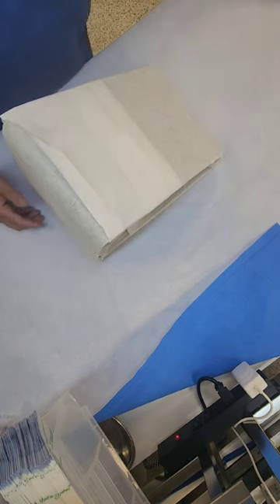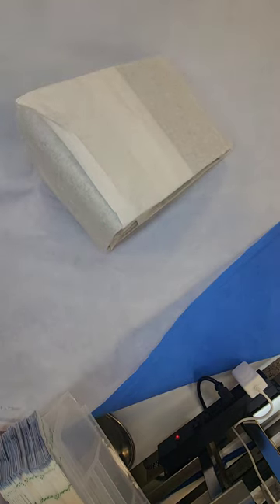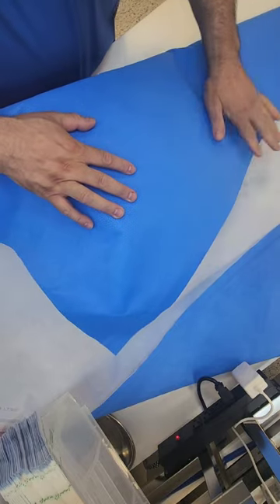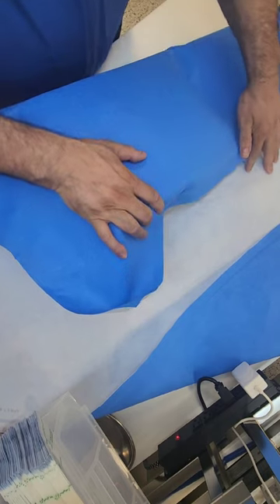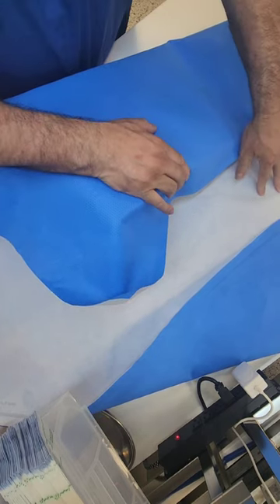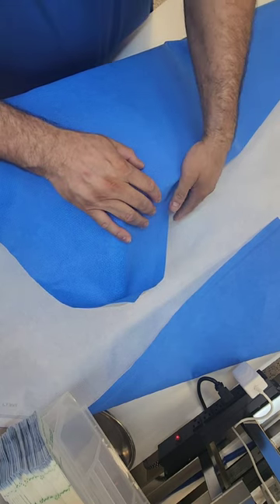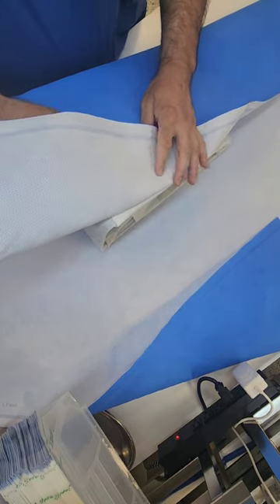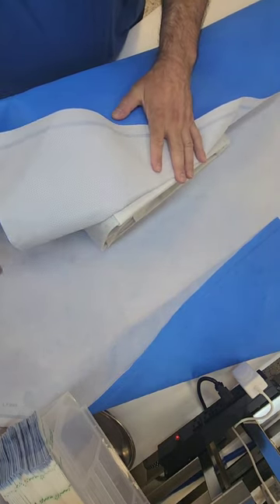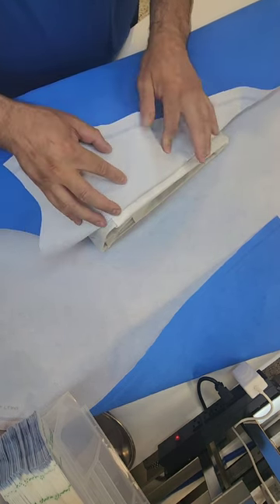Unfortunately, this triangle I have is a larger or medium triangle, and I do not have the correct size wrap for it. This is a 45 by 45. I wish I had a 48 by 48 so I can get complete coverage in the back. But because it's a 45 by 45, I'm just demonstrating this wrap for you guys. Eventually I will wrap this in a 54 by 54, which is actually a lot of wrap, but that's the next size we have. So in order to properly wrap it, that's what I would use.